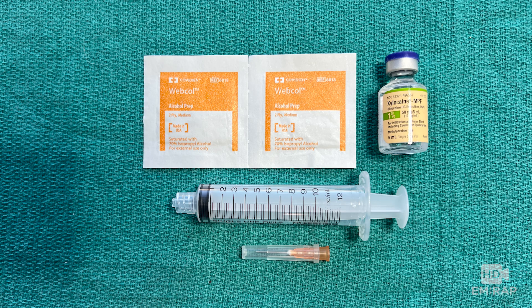For all of the techniques, the supplies you need are an antiseptic solution or alcohol prep pad, local anesthetic, a syringe, and a small gauge needle such as 25 to 27 gauge.